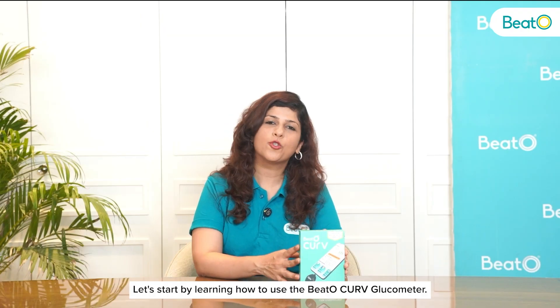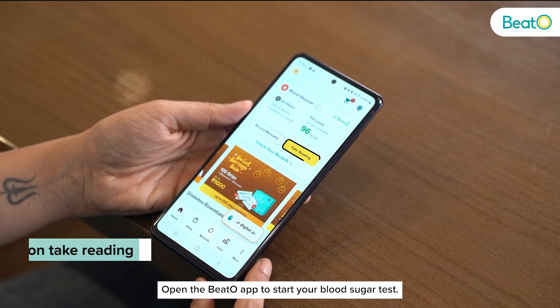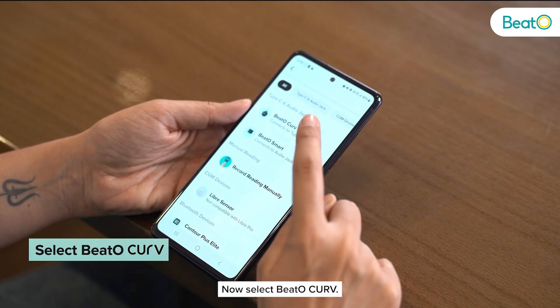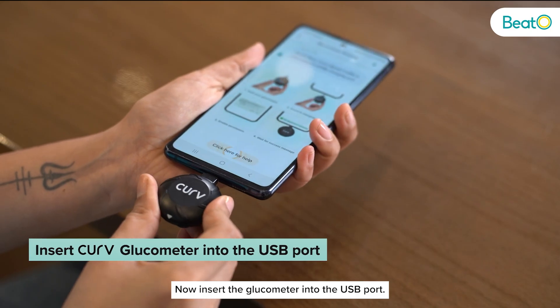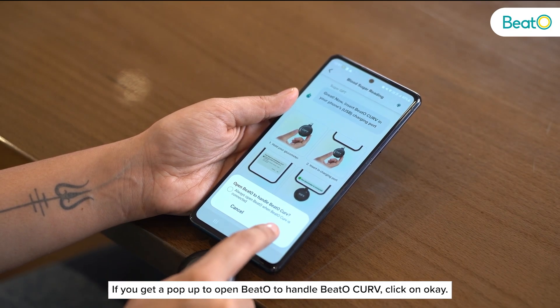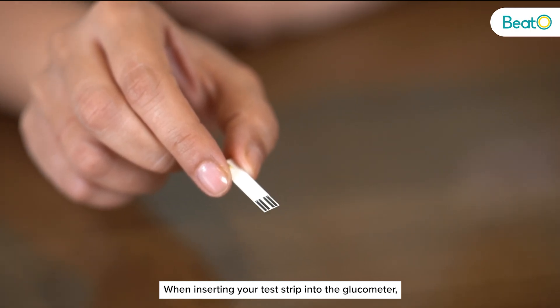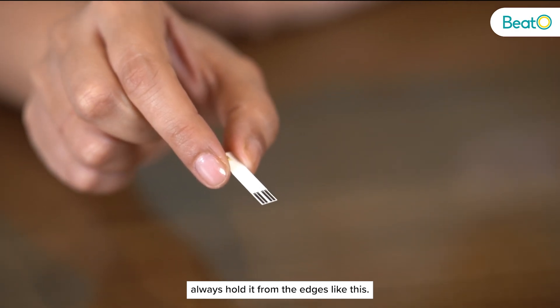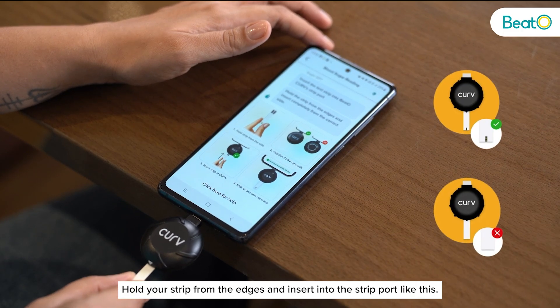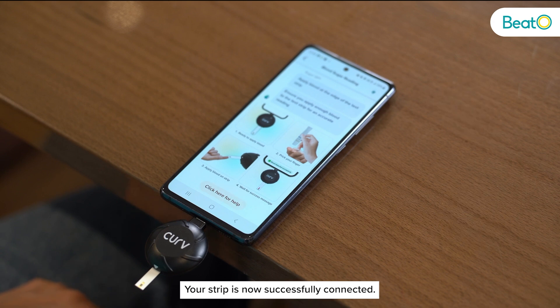Let's start by learning how to use the Beto Curve Glucometer. Open the Beto app. To start your blood sugar test click on 'Take Reading,' then select Beto Curve. Now insert the glucometer into the USB port. If you get a pop-up to open Beto to handle Beto Curve, click on OK. Now we're ready to insert the strip — when inserting your test strip into the glucometer always hold it from the edges and insert it into the strip port.